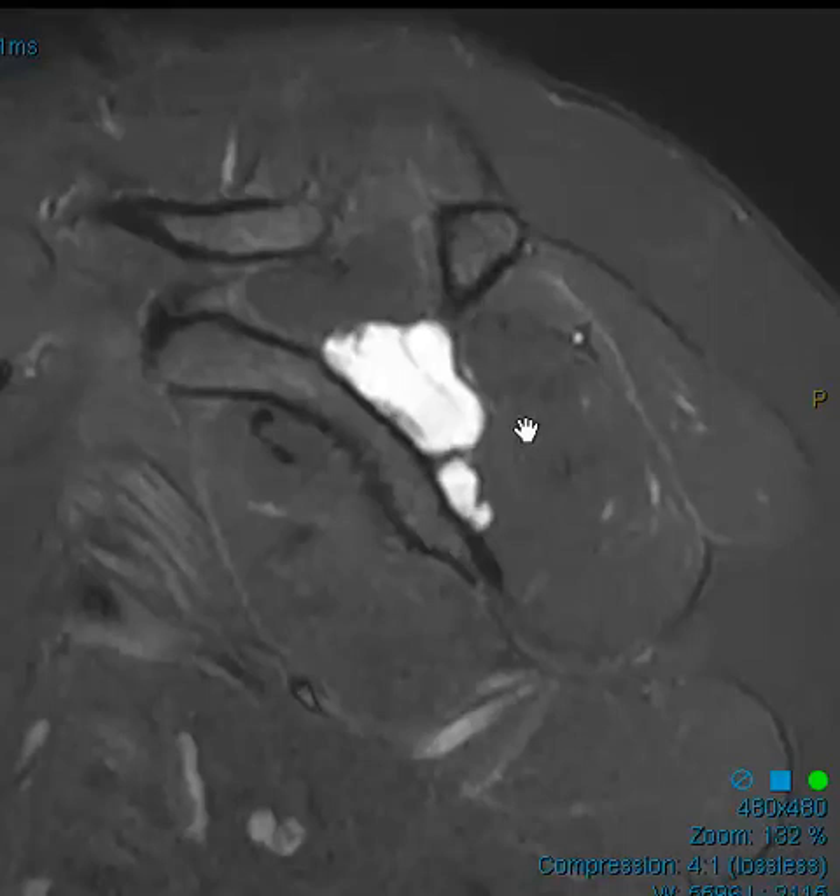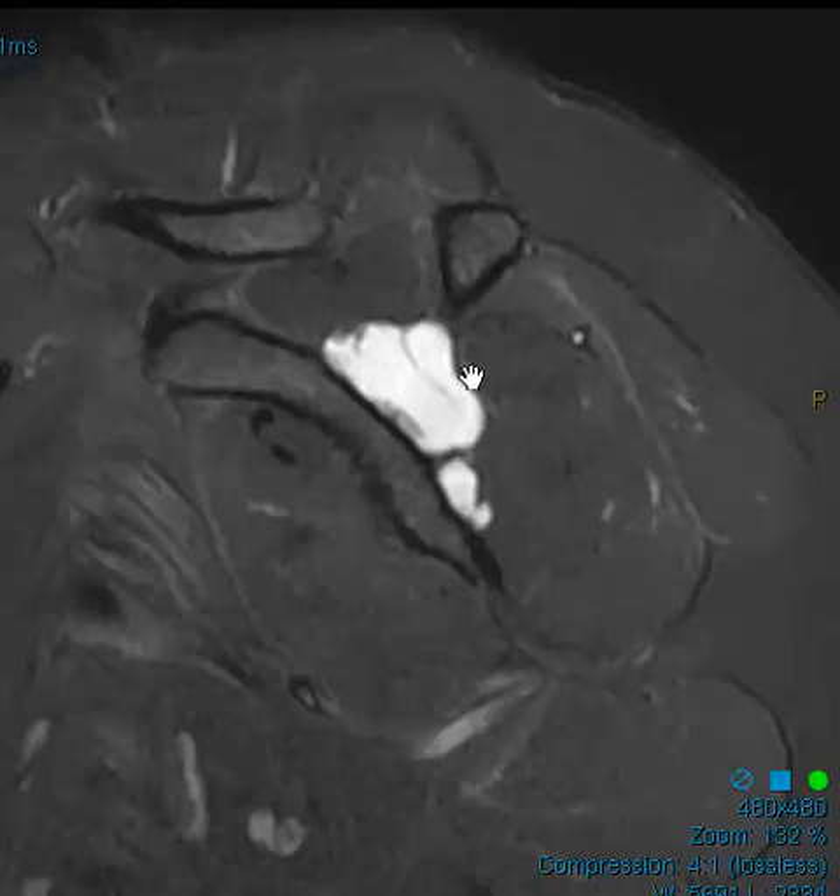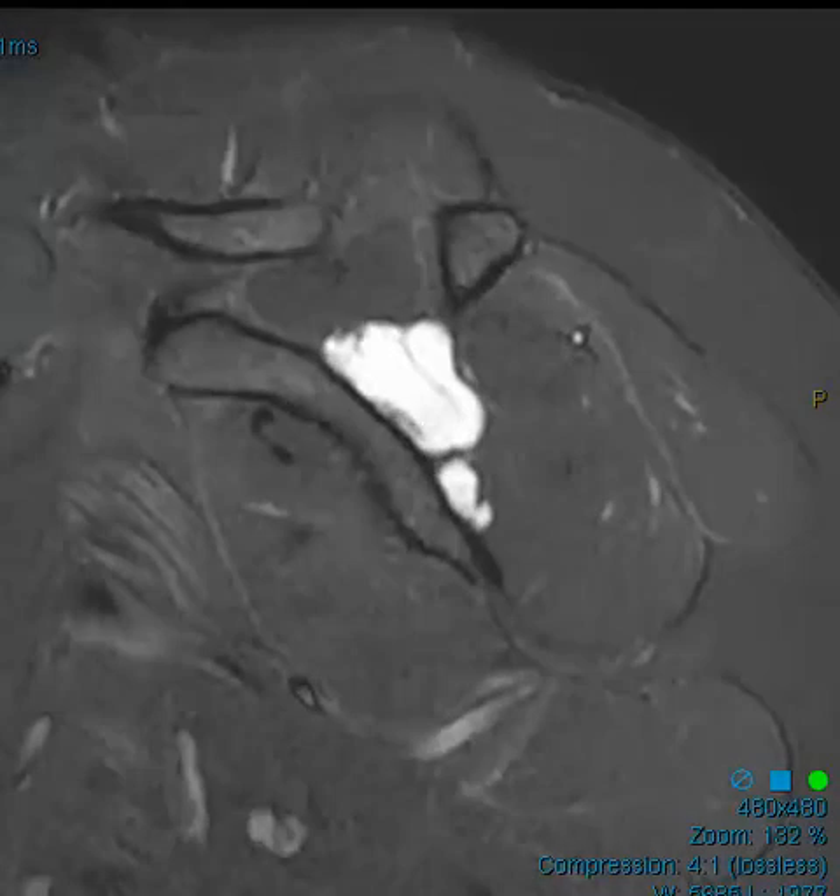The last thing is to mention whether or not there's any suprascapular nerve compression. Anytime there's something in the spinoglenoid notch, we know the nerve that goes through there — called the suprascapular nerve — innervates two muscles: the supraspinatus and infraspinatus. These two muscles are innervated by that nerve that courses through there, and we look for edema or atrophy.